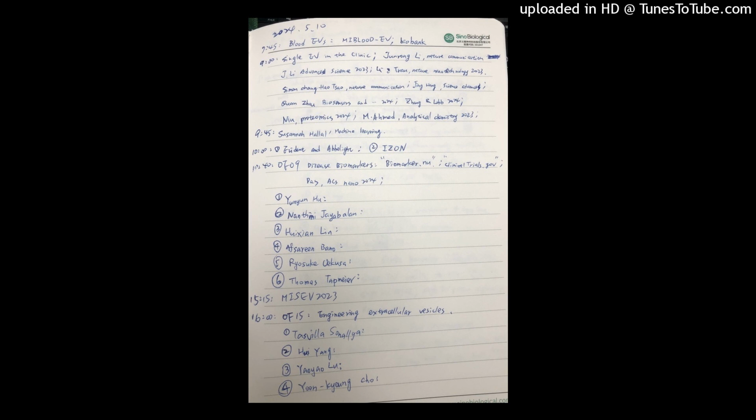That's why we have the checklist, but we would like you to also try to measure, for example, the concentration of platelets, and report the hemolysis and the fat. That's all. And we think that by reporting these 3 additional parameters, at least for blood, plasma and serum, you can really improve the quality and the comparability of downstream research.